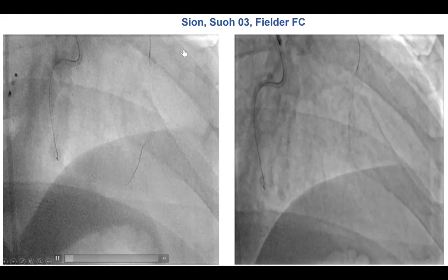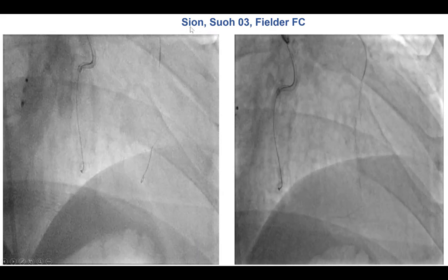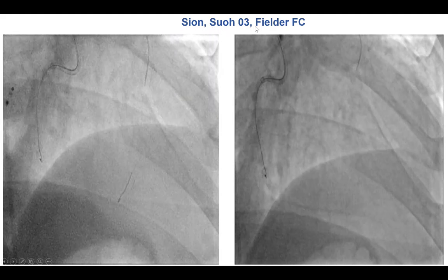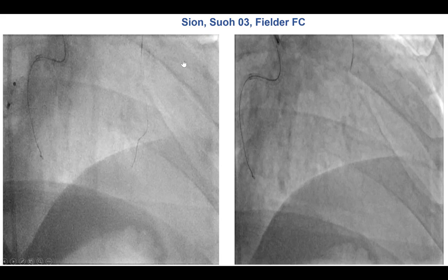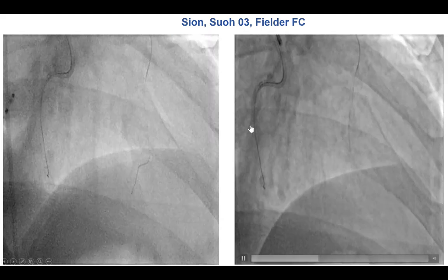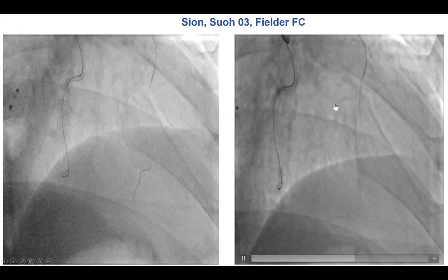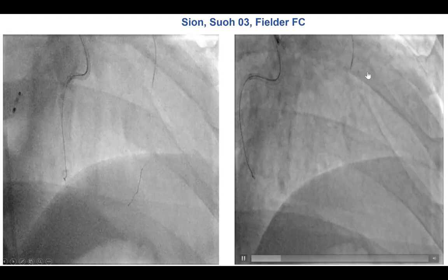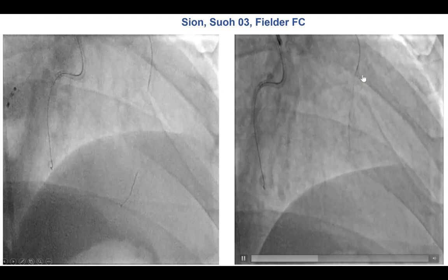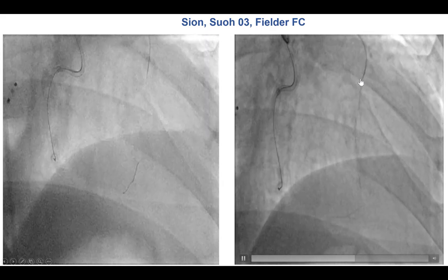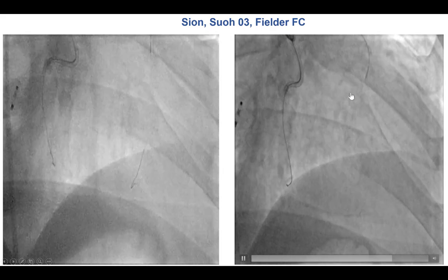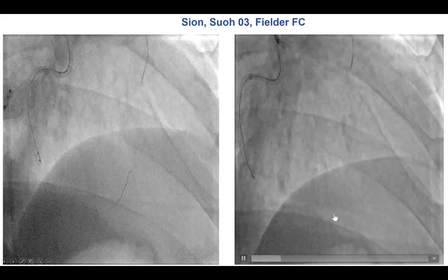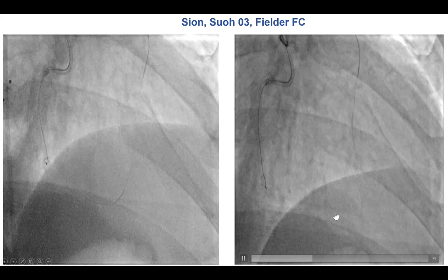Surfing was done using the Sion, the Suoh 03, and the Fielder FC guide wire. However, it was not successful and that is why contrast injection was performed through the Corsair, which did demonstrate some continuous connection all the way to the PDA.